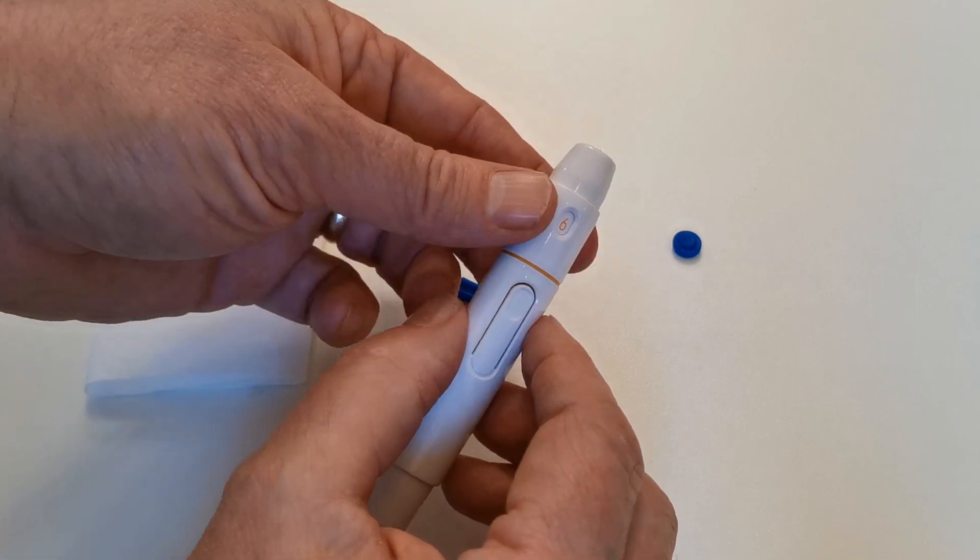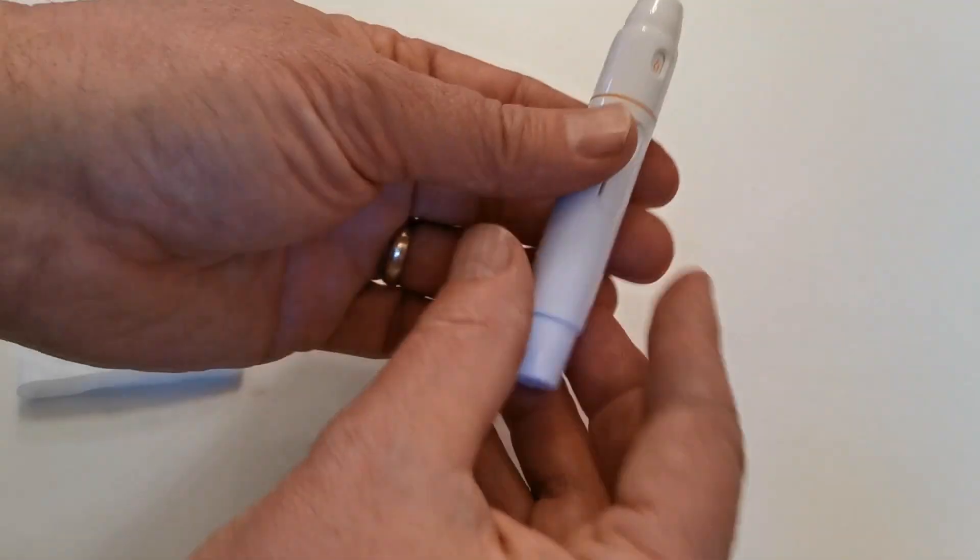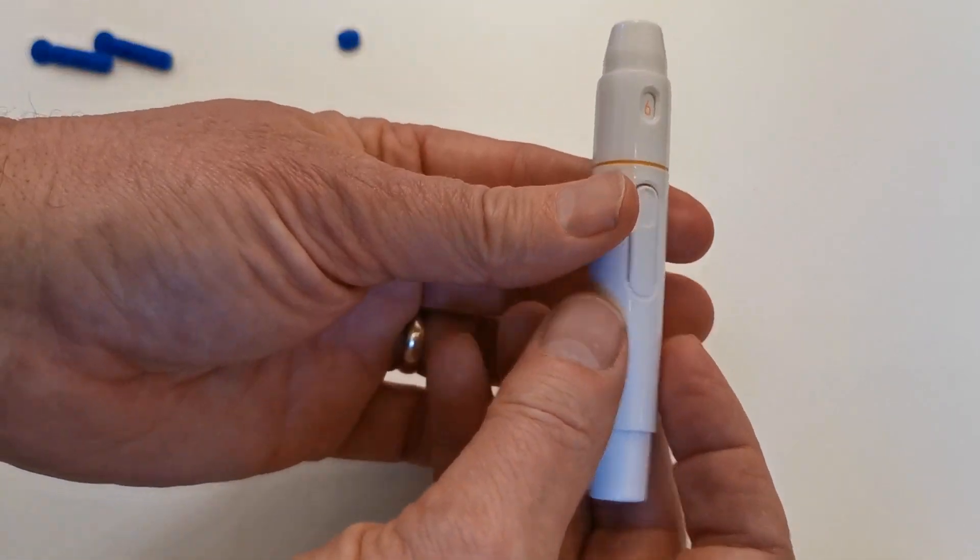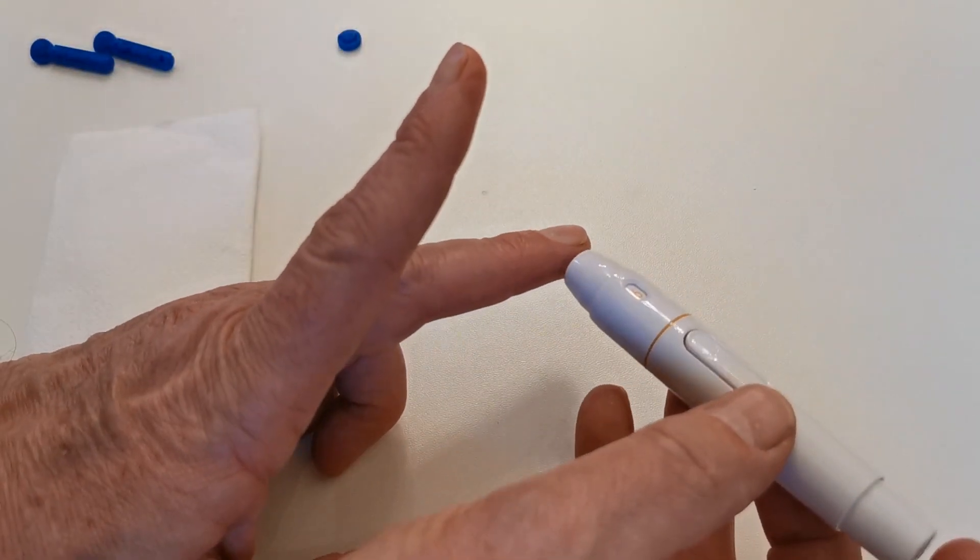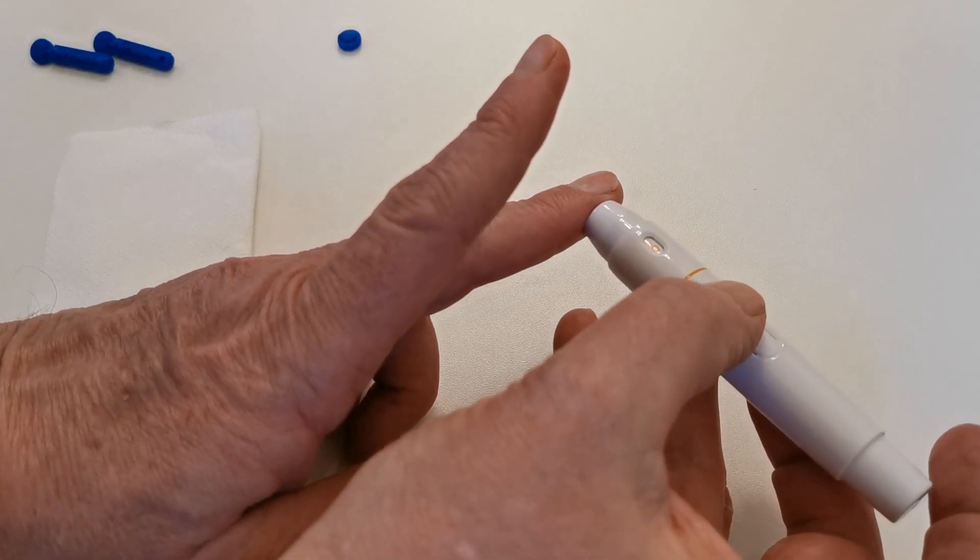We've got at least, I think, two mils there setting on six. So, when you're happy with that, set the lance spring, apply it again firmly against the side of the finger and trigger the lance.